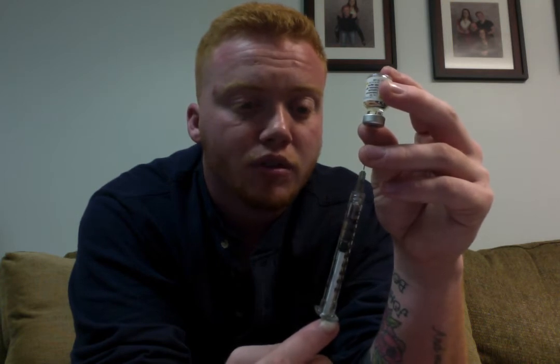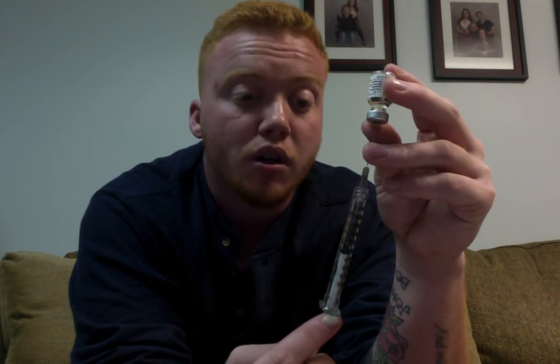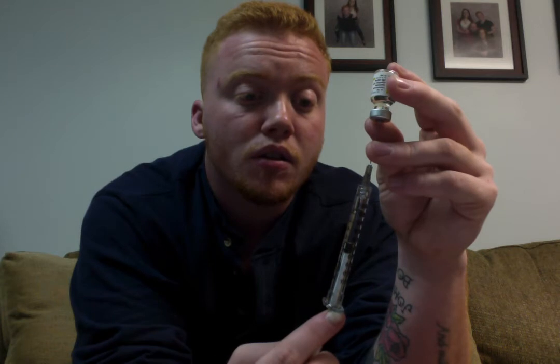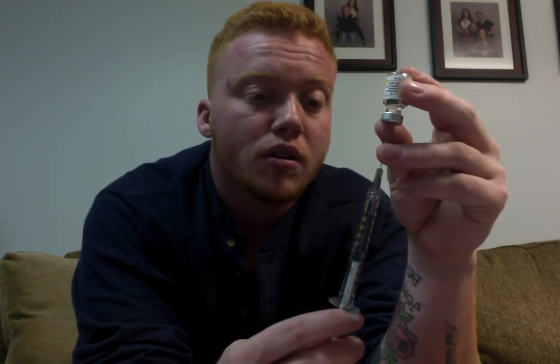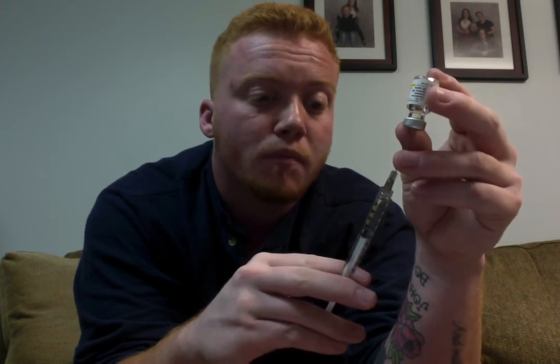I'm slowly pulling back on the syringe and letting it fill, watching for any air bubbles — that's important. This is the longest part of the whole process. I end up pulling it down past the 0.4 mark and then pulling back to 0.4 to get the air out. Then I dispose of my drawing needle.